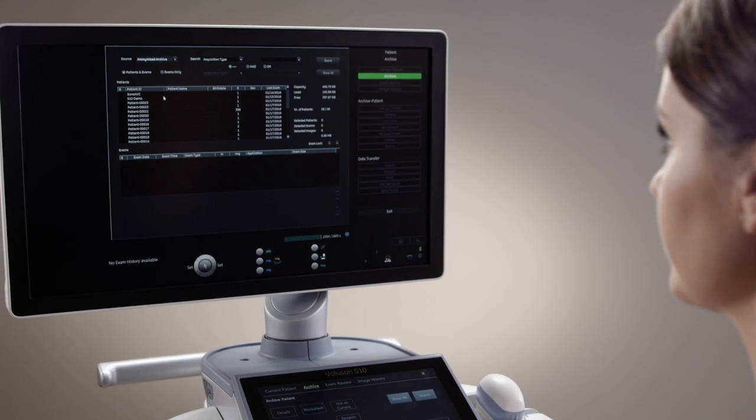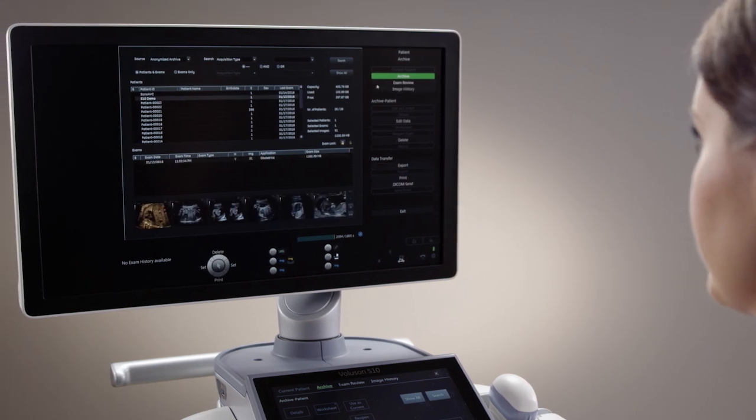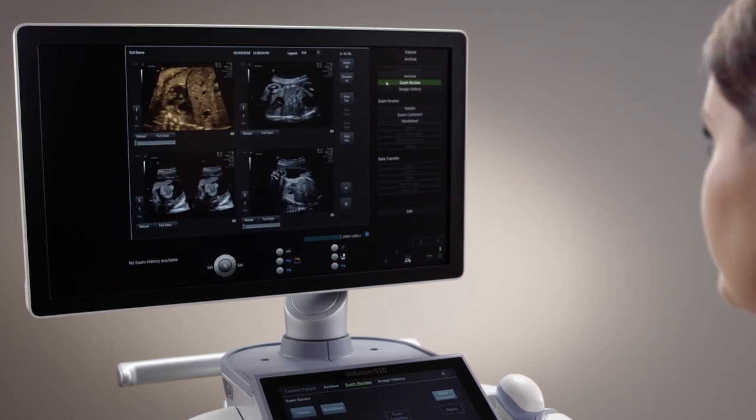The Voluson systems offer a robust and easy-to-use archive package to help meet your daily image management needs.